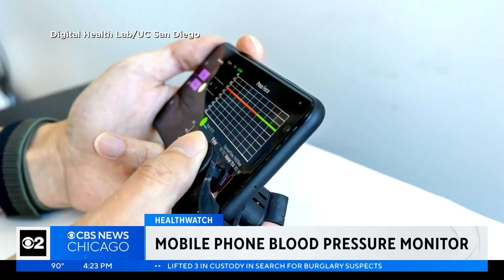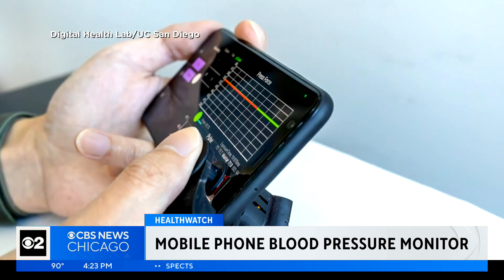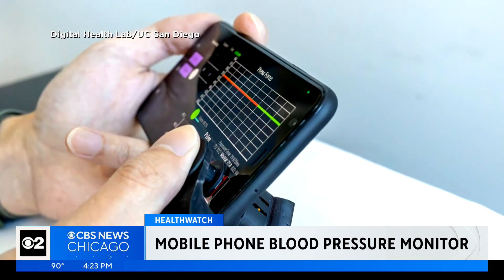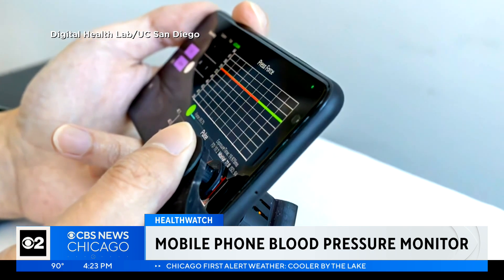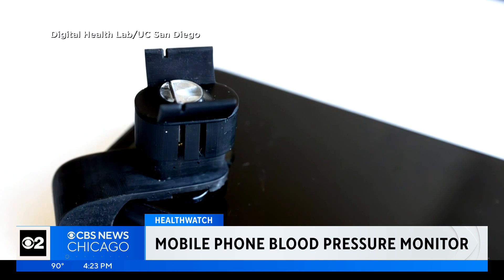At-home check-ins are a must for many people with blood pressure issues. Now, engineers at the University of California San Diego have developed a new low-cost smartphone attachment that brings blood pressure monitoring to your fingertips. It involves a 3D plastic clip that uses the phone's camera to monitor blood pressure.